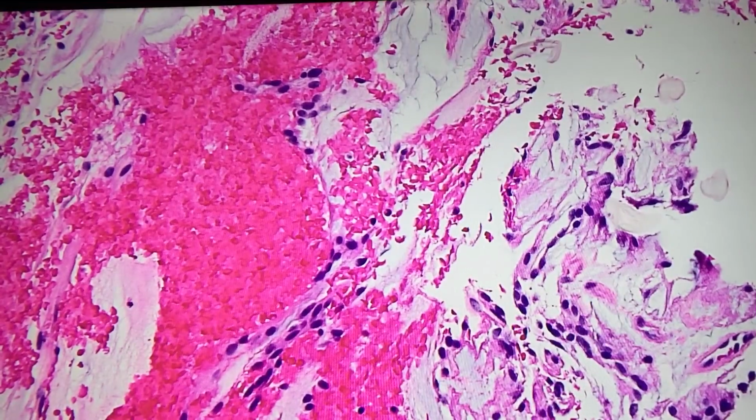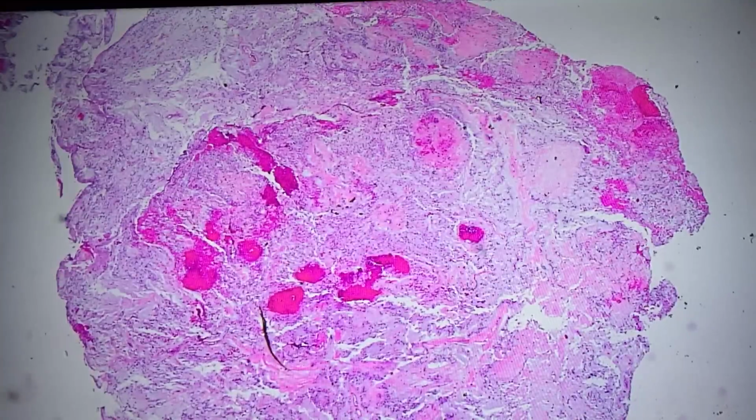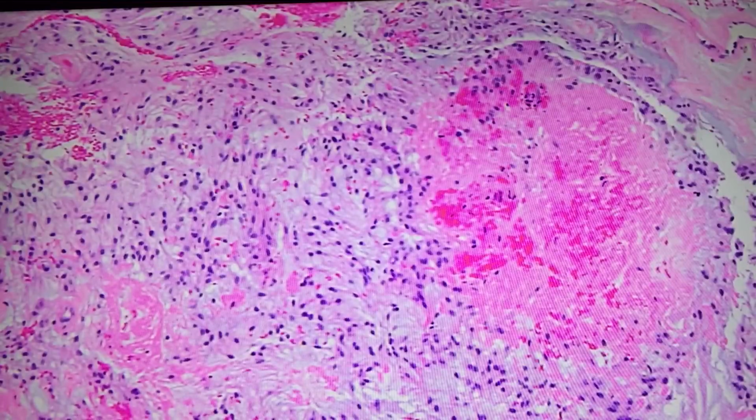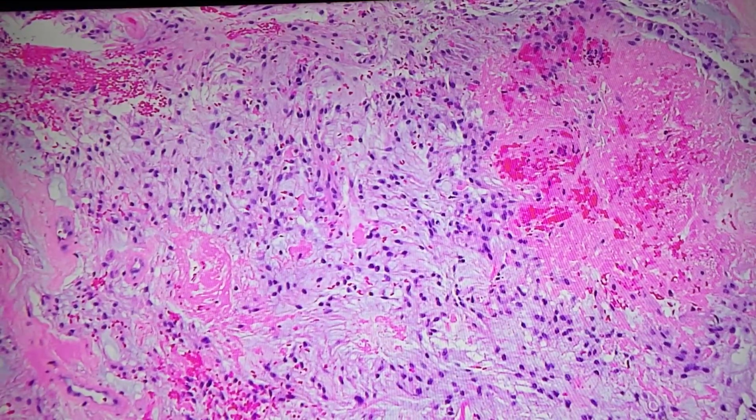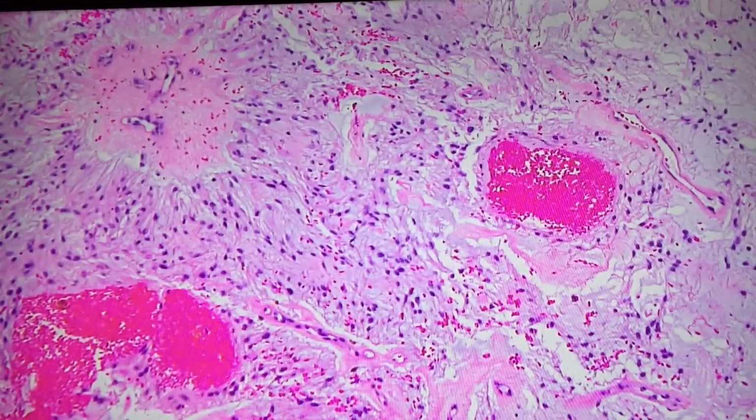Okay, let's go fast. Now we'll speed up and try to show them all the rest. Instead of picking on anybody, we'll just show you quickly and have somebody take a guess at it. Anybody? Anything else I should show, Erica? Low mag, different areas?